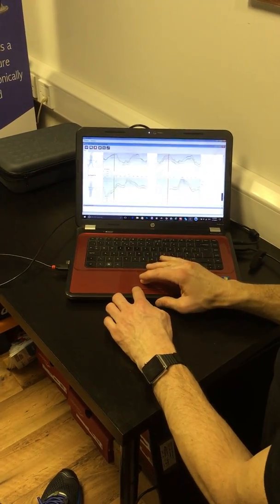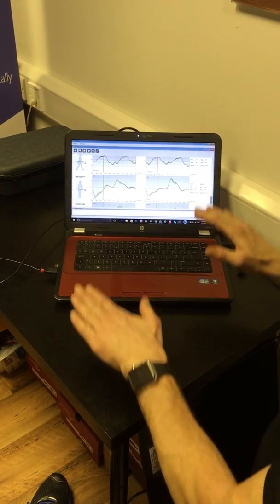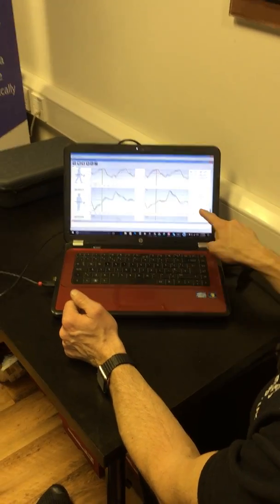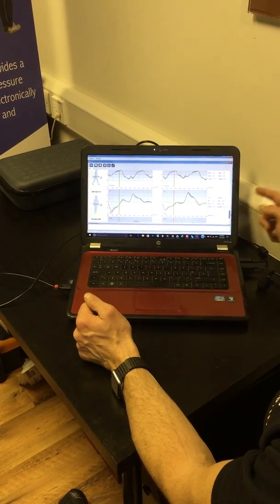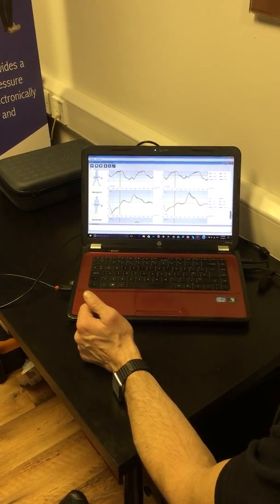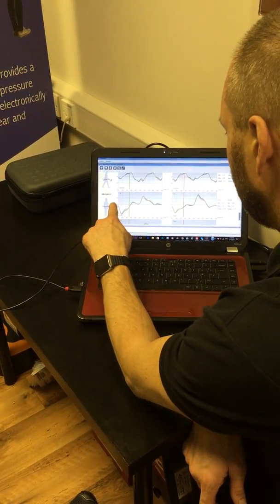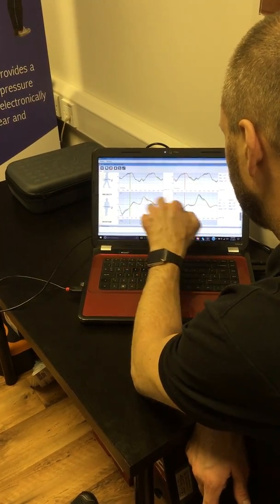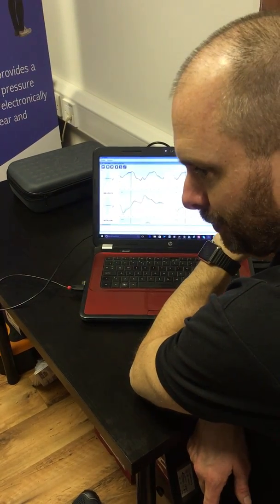Now we look at your obliquity. I could see from when you were running, you slam down your left like this. I'm expecting this to look a little bit different. So we find that the minimums and the maximums are different, and the range is different. We'd expect that just from listening to you, let alone watching you. But as we plot the graph, it's probably not as bad as we think. At least it's doing the same thing.